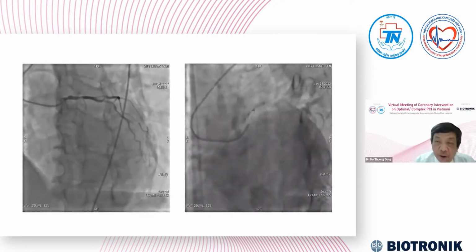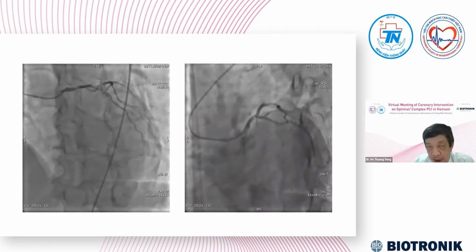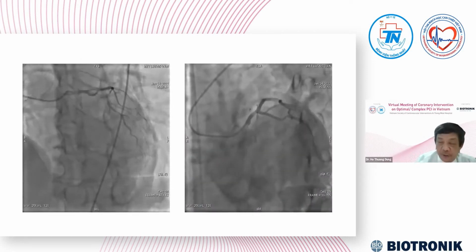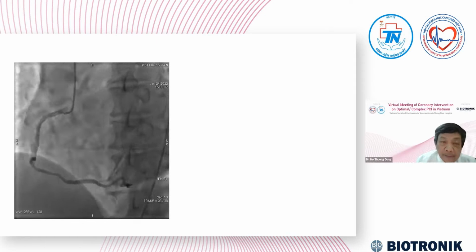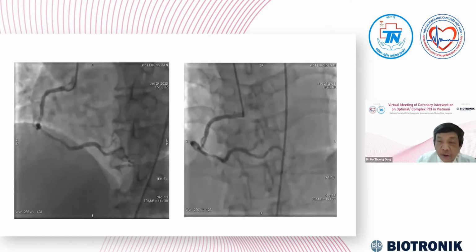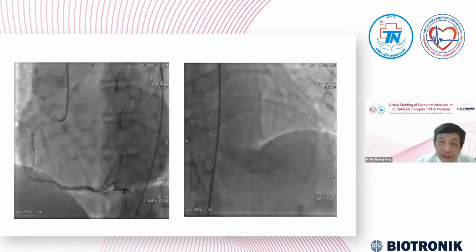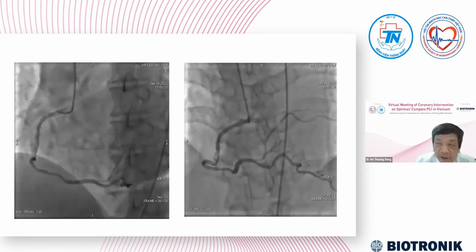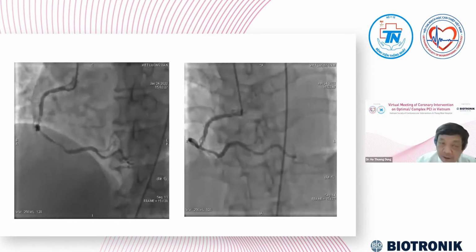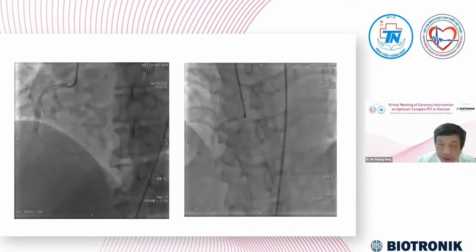In our hospital, do we go to the left coronary artery to open, or do we continue with the right? And when we checked the right, we can see the collateral to the left is very abundant. So I think the complete lesion matched the symptoms and signs because of the right. So we try to do something in the right coronary artery.